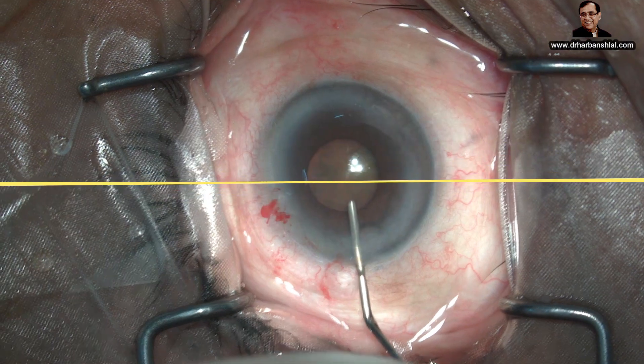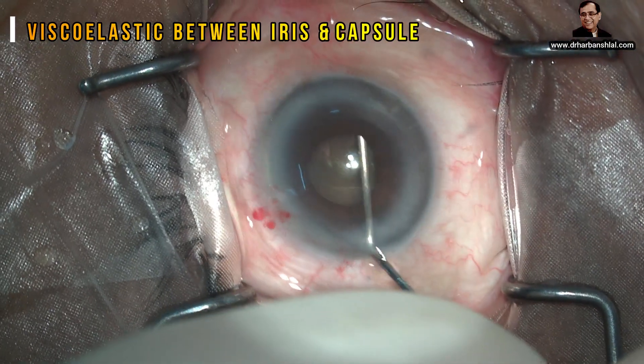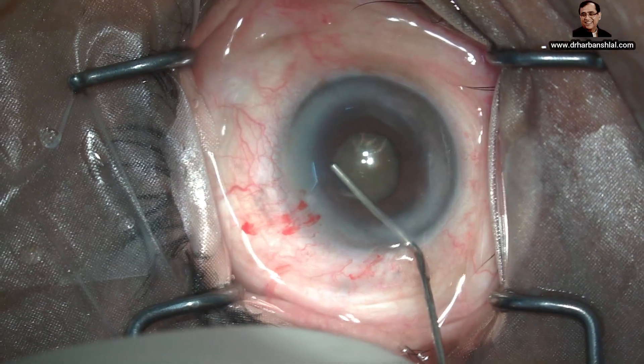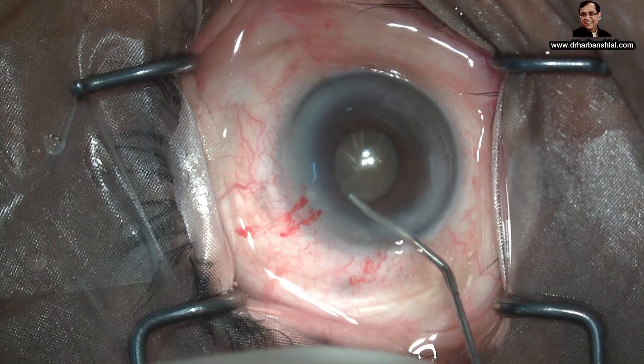For implantation of the Malugan ring, we must inject viscoelastic between the iris and anterior capsule at all the places where the scrolls are going to come. This is a very essential step.